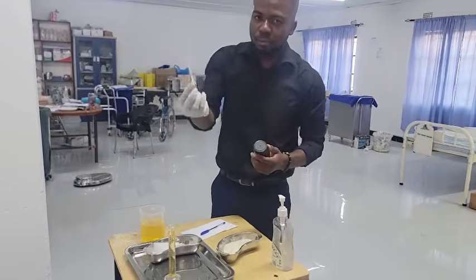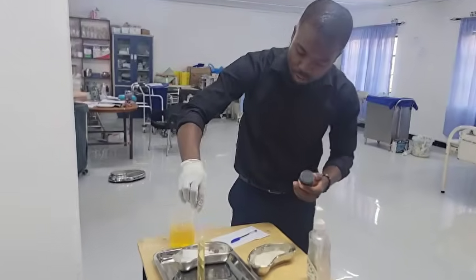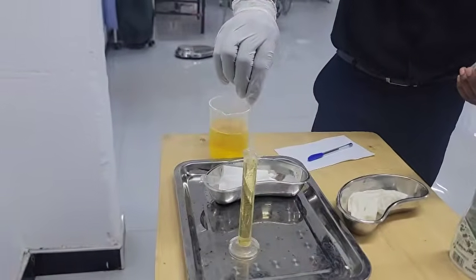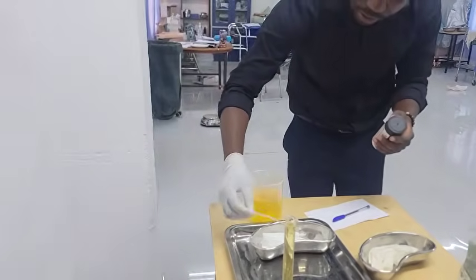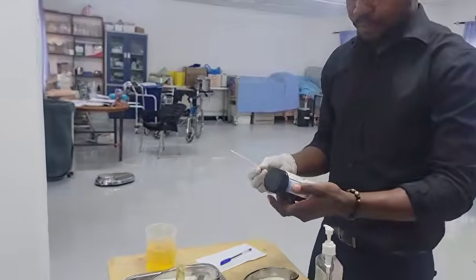Then you are going to dip this strip in urine. So you are going to dip this at least 2 to 3 seconds. After you do that, you have to remove the urine there, and then you are going to do this now.